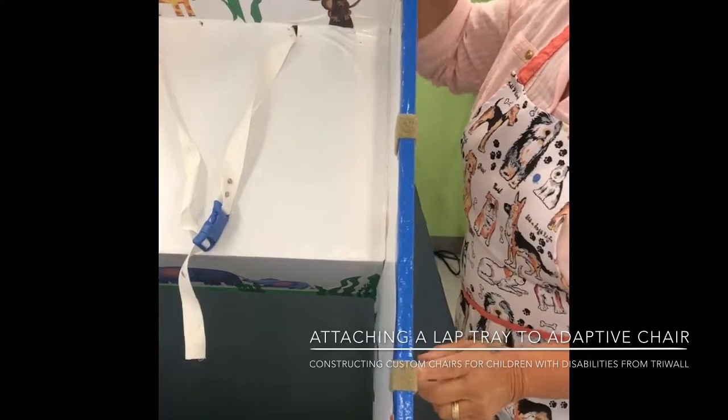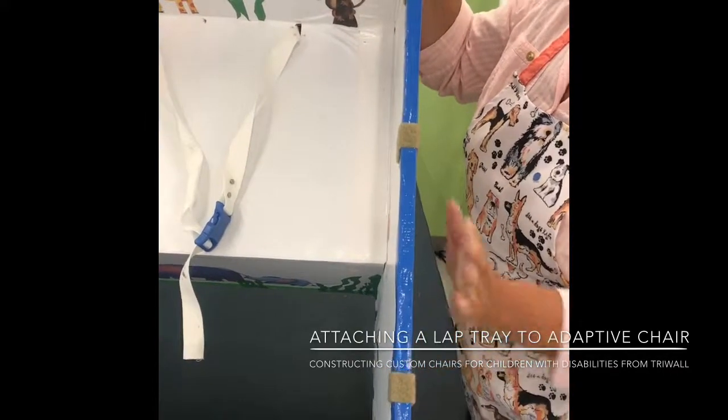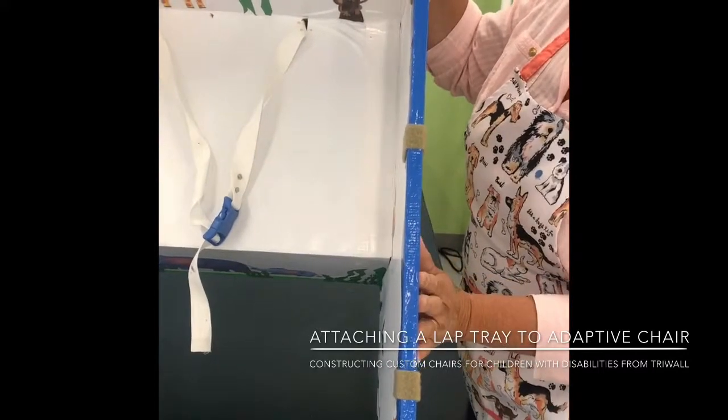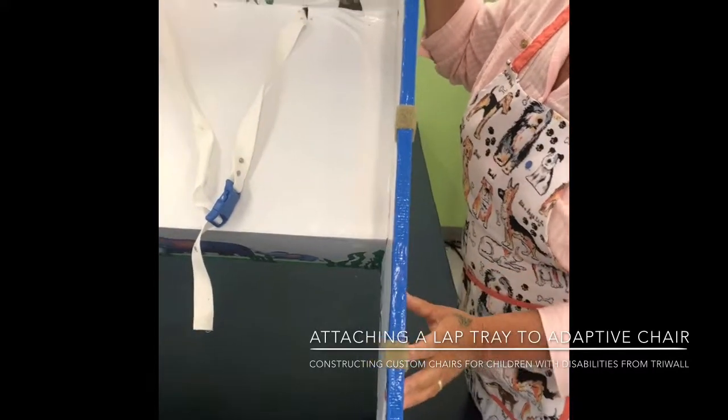The strips aren't going to attach — they're not going to stick to the cardboard. So the unit, for many reasons, needs to be covered with tape and/or contact paper.